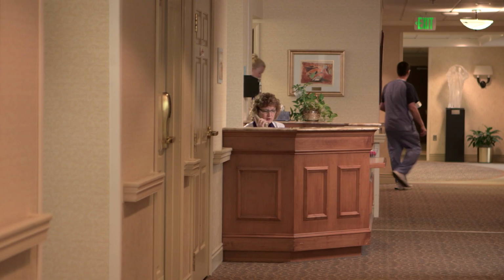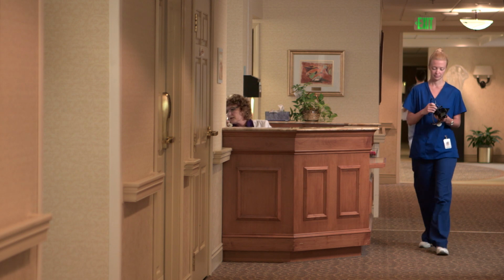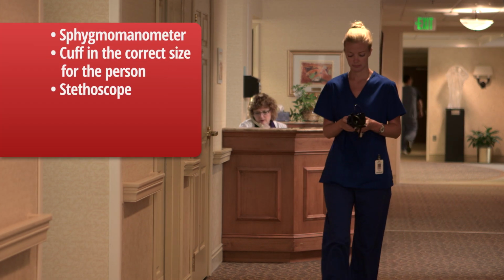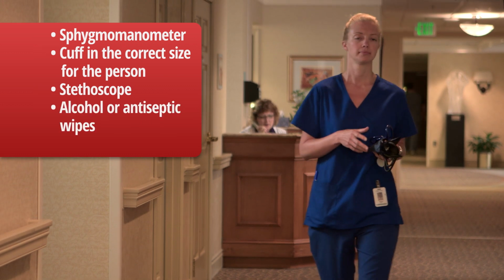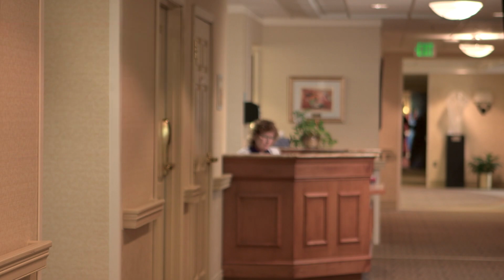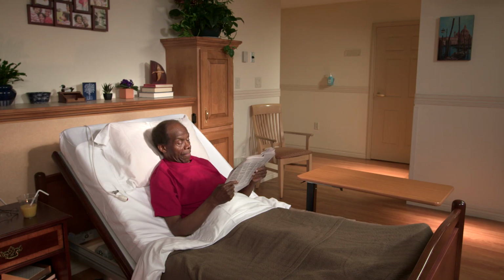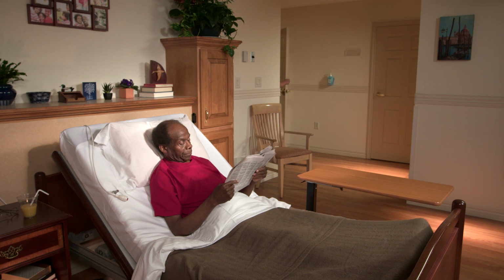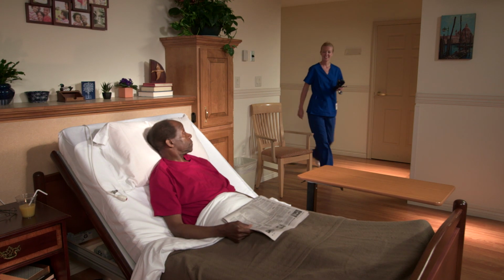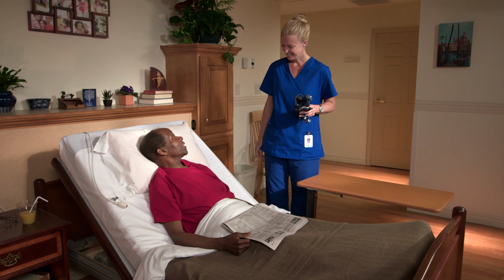To measure a person's blood pressure, begin by washing your hands and gathering your supplies: a sphygmomanometer with the correct cuff size, a stethoscope, alcohol or antiseptic wipes, and a pen and paper. Follow your preparation steps. Knock, introduce yourself, greet and identify the person, and ensure the person's privacy. Explain what you are there to do and ask permission to continue.